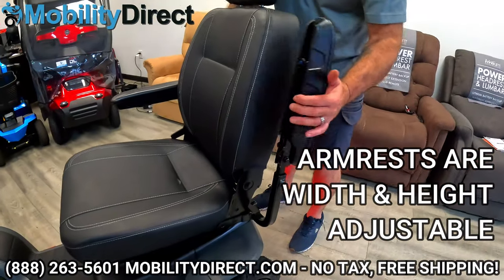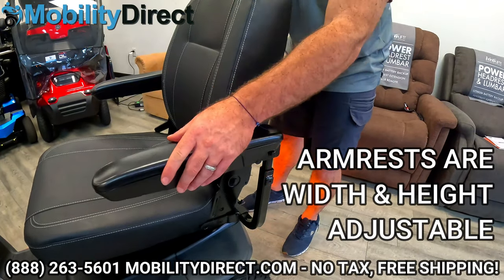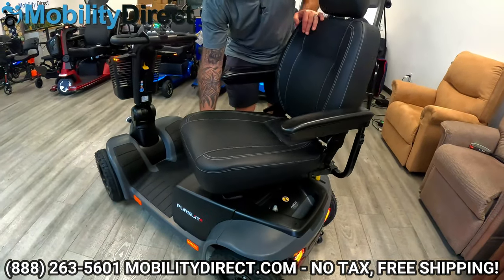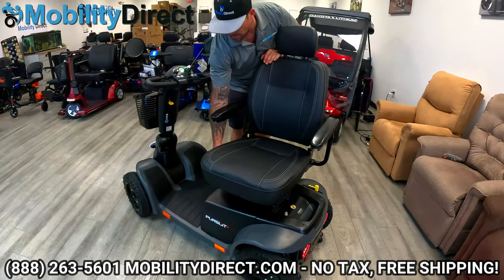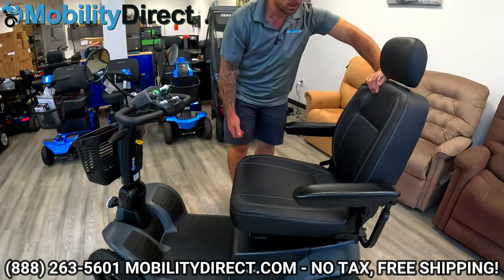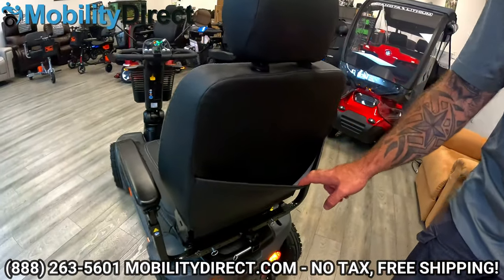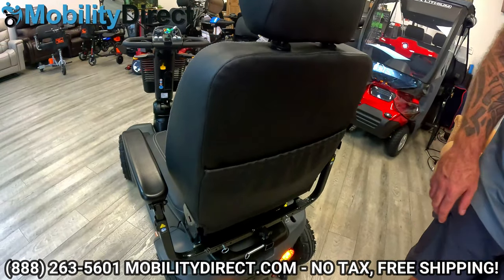The armrests are adjustable in width, and they can also flip up so you can get out of the scooter easily. The seat rotates for easy entering and exiting of the scooter. On the back of the chair, you have a pocket — you can put some literature, your manual, or whatever you like in there.